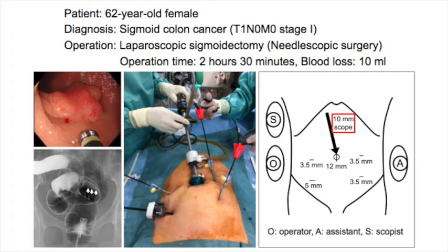A 12 mm port is placed at the umbilicus for a 10 mm scope. A 5 mm port is placed at the right lower quadrant, and 3.5 mm ports are placed at the right and left lateral and left lower quadrants.